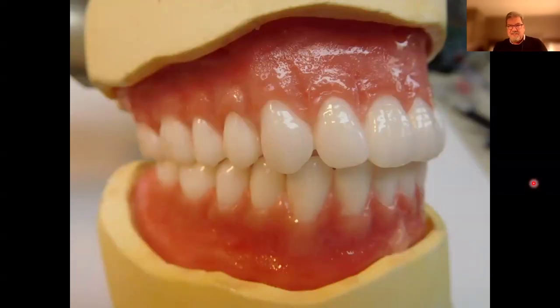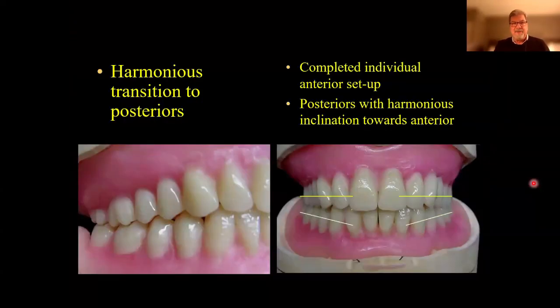This is the technique I've used all these years. I remember when I was managing a large laboratory in North Carolina, and they asked me to talk to the technicians there and give them an easier way to set up denture teeth. And they suggested the template method. So I'm going to talk about that template method in a little while.